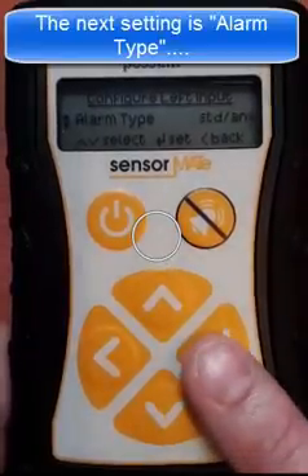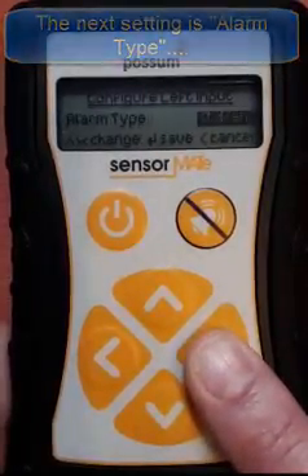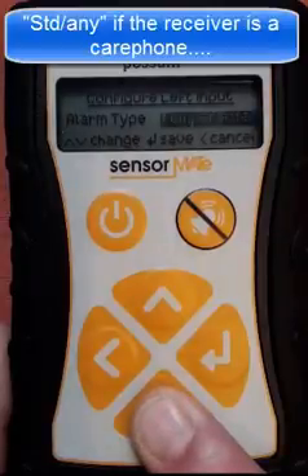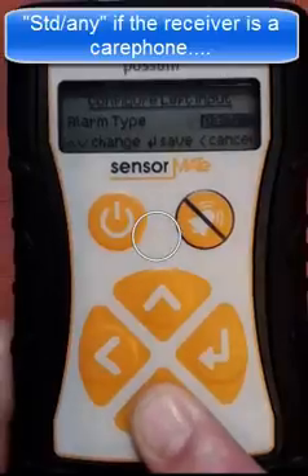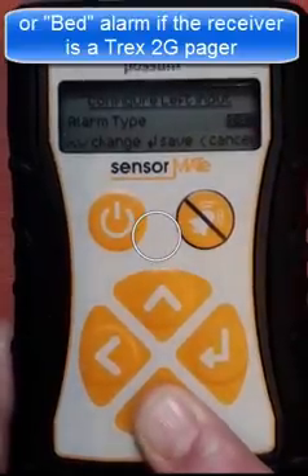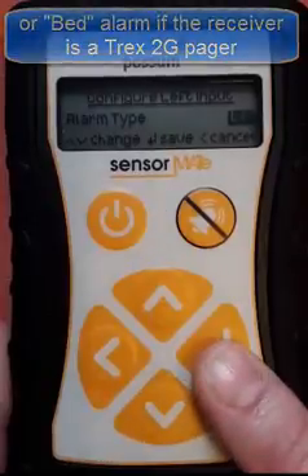The next setting allows the adjustment of the alarm type. For occupancy solutions, this should be set to standard any if the receiver is a care phone. However, it can be adjusted to bed alarm if the receiver is a Trex 2G pager.